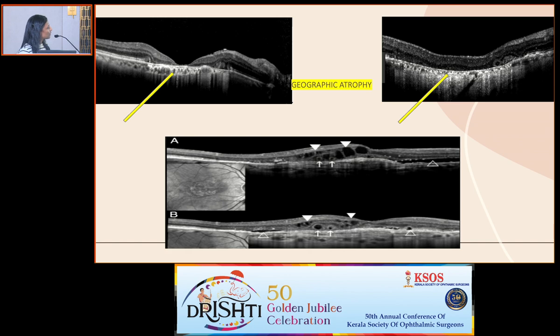This is the chronic inflammation photoreceptor rearrangement. So you can see a hyporeflective lumen surrounded by a hyperreflective ring. This should be differentiated from the hyporeflective intraretinal cystic spaces. That is, this will be purely hypo, and in this you can see a hyperreflective lumen. So the outer retinal tubulation is a sign of chronicity.